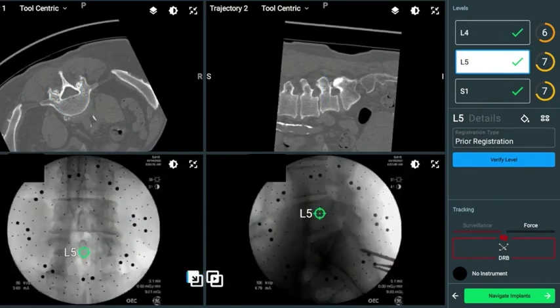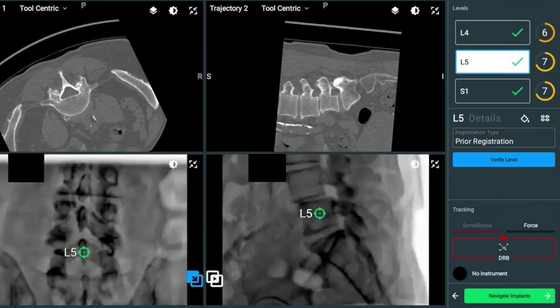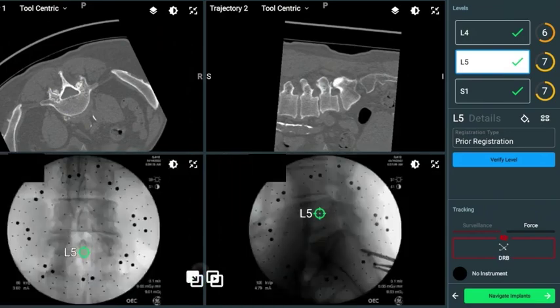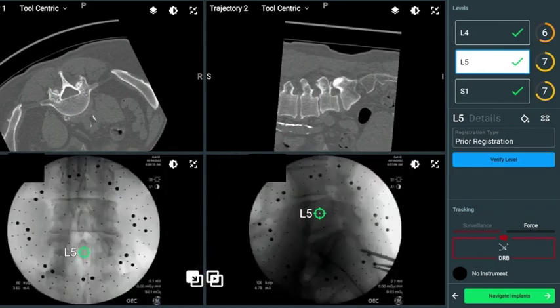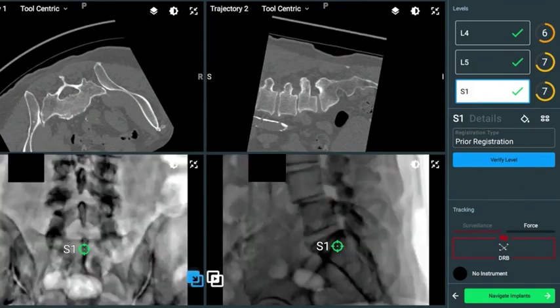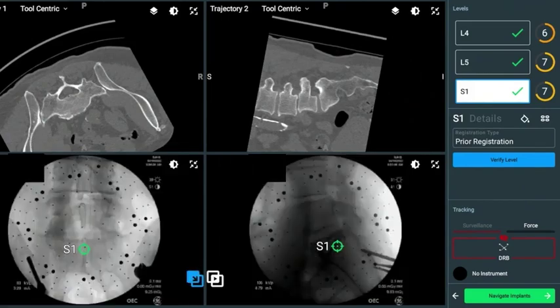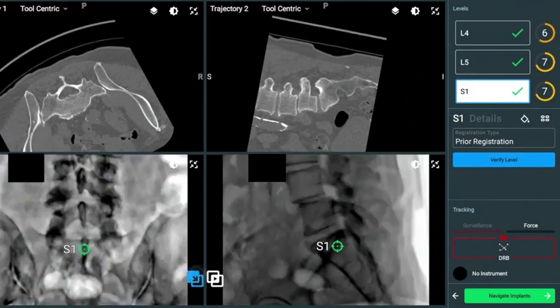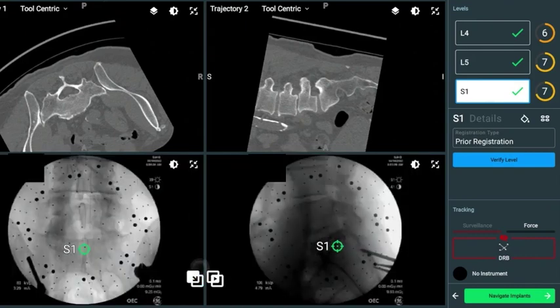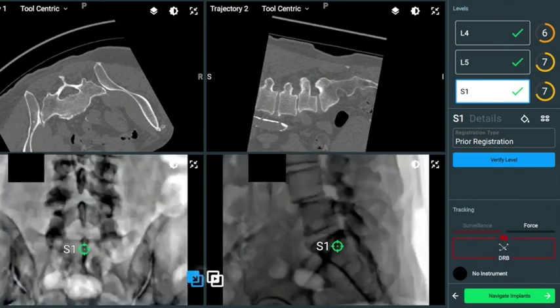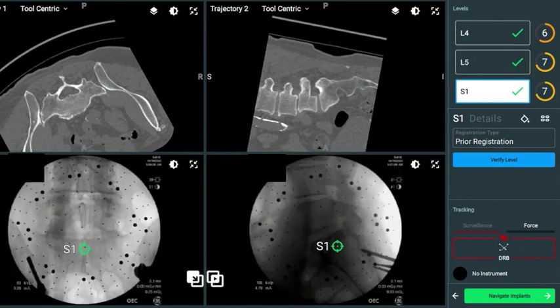Here you can see the static position of L5 with the gross motion of L4 representing the difference in position prone on the Jackson table versus supine in the CT scanner. Again, we see this at S1 with a static image merging between the CT and the fluoroscopy shot of S1 with motion at the L4 level.